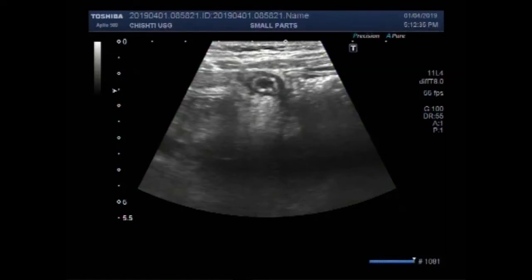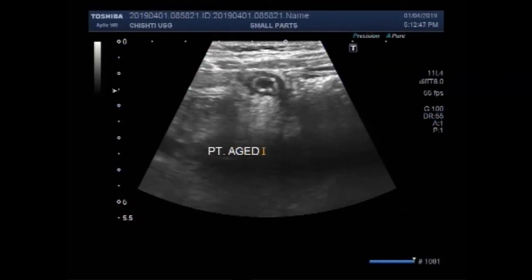Dear viewers, I hope you are all fine. This ultrasound video shows a case of acute appendicitis. The patient is aged about 10 years, and you can see the vertical view of the in-plane appendix.